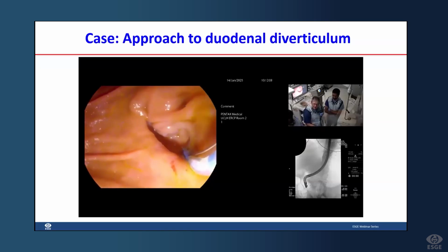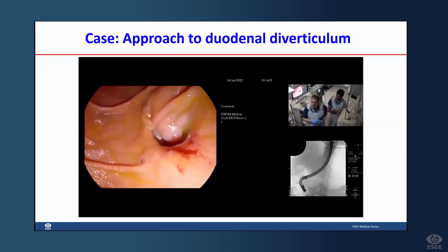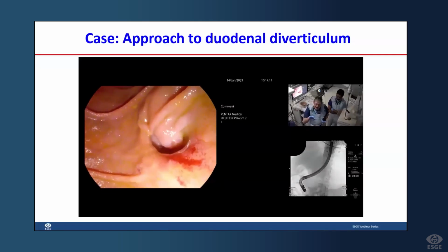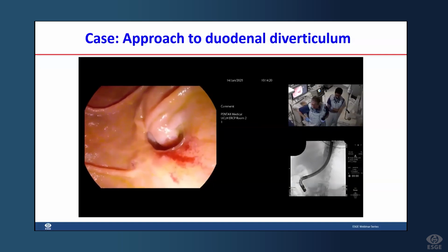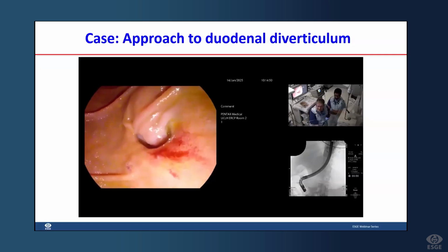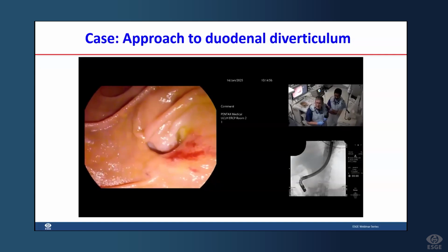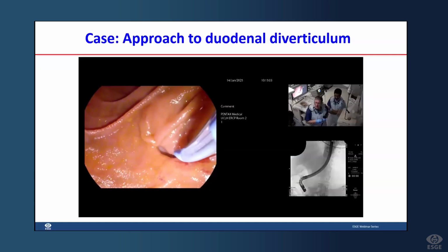My sphincterotomy is just getting caught on the edge of the diverticulum. So it doesn't look difficult, this, to be frank. Problem is that because there is a natural bend on the sphincterotome, it catches that outer lip of the diverticulum and then takes you away from the papilla. It'd be an interesting discussion as to whether people would just go straight for a pre-cut sphincterotomy here. There are other techniques that we sometimes use with duodenal diverticulum. Sometimes we try and clip above the papilla just to move folds out of the way. There we go.